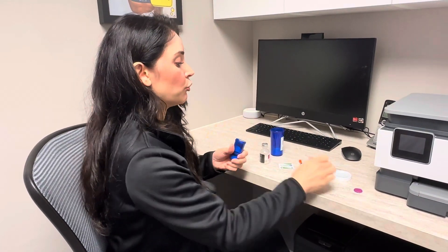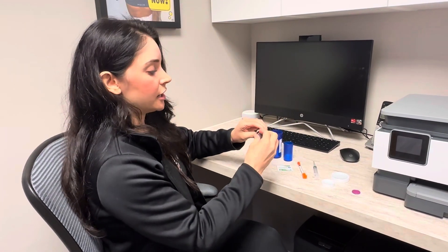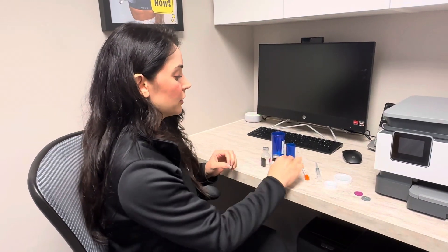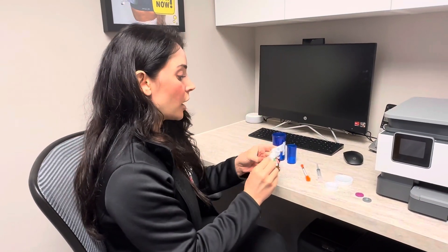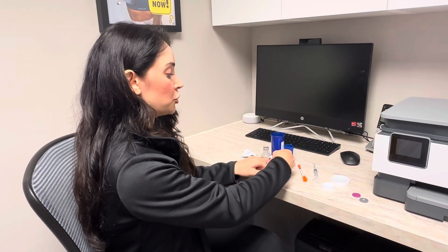Let's go ahead and pull out our medication that we're going to reconstitute. Pop that cap off and now we're ready. Always take your alcohol swabs — you're always going to want to disinfect your tops before poking your needles through.